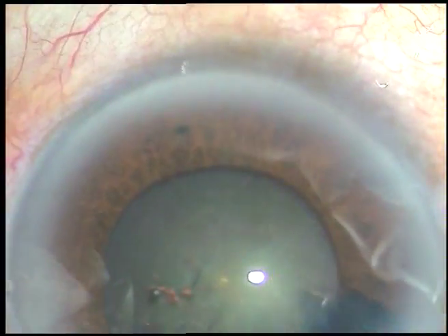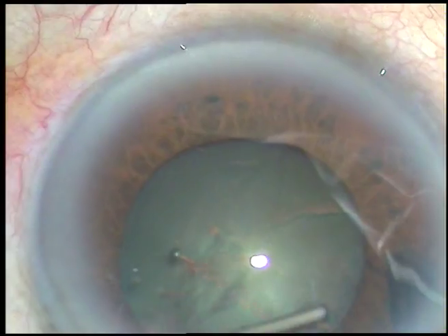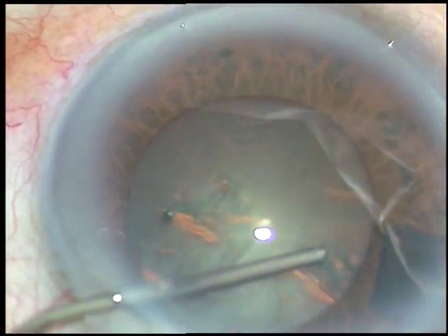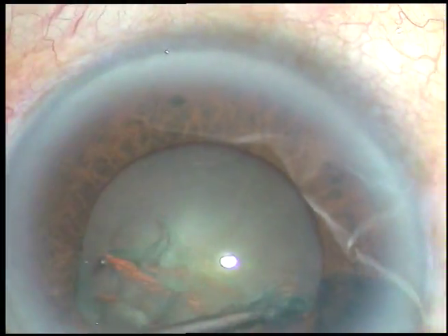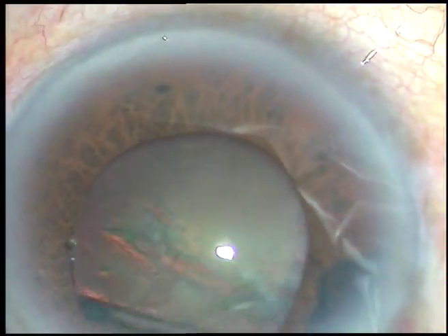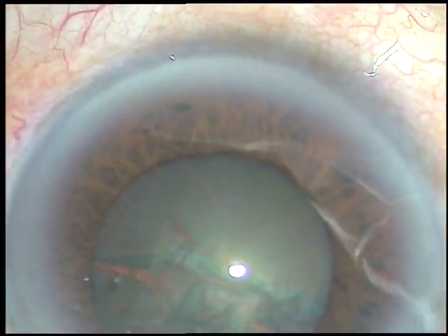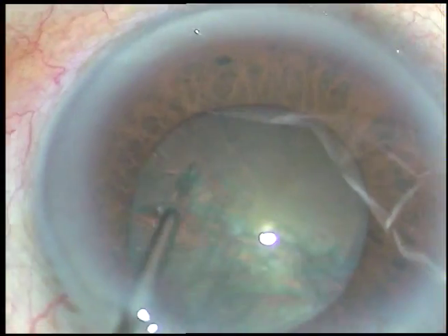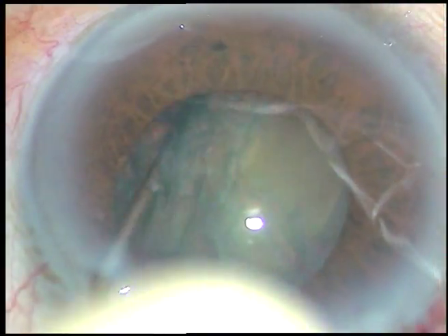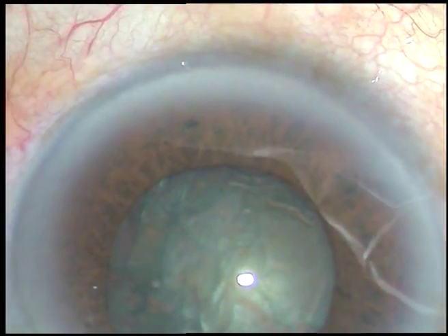The rhexis has been done and it is quite adequate. Now hydrodissection is to be done. At all these tips, we must take care not to deliberately touch the iris. We must be very careful — accidentally also we should not touch. So we should prevent those movements and take utmost care not to do those movements that will cause iris touch.